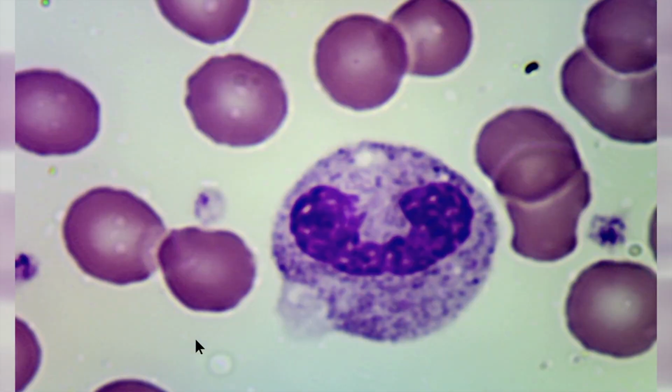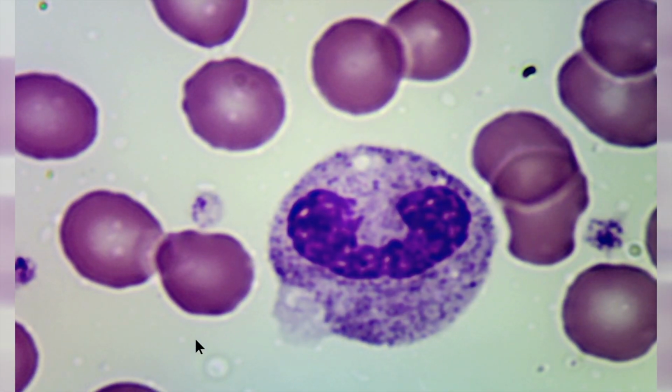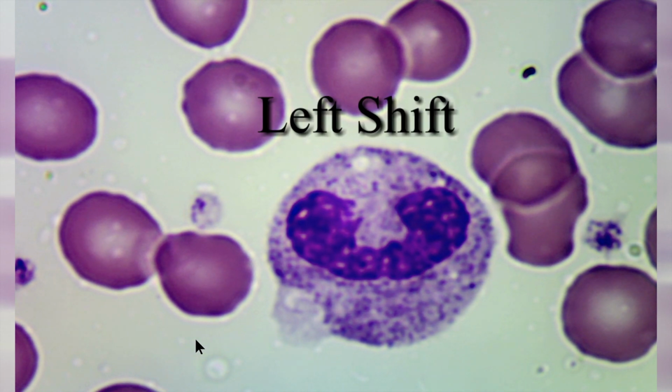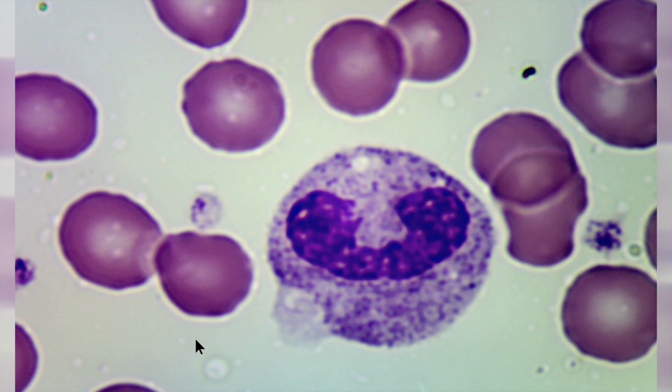We do have another band neutrophil. So it seems that the band neutrophils in the slide are elevated, and that indicates a mild left shift, which means for whatever the reason, likely due to an infection, the bone marrow releases younger white blood cells, in this case neutrophils, into the circulation, and that is why we do see an increased number of bands. Usually about 1 to 3% of the white blood cells should be band neutrophils.